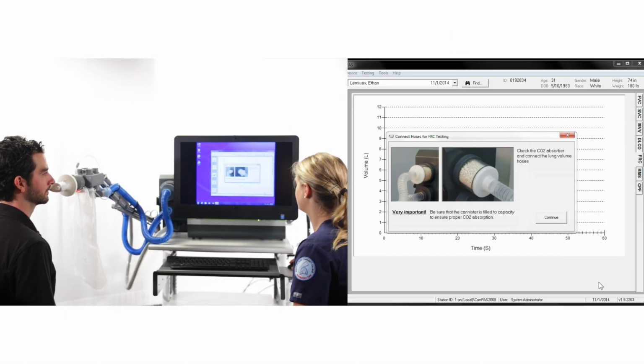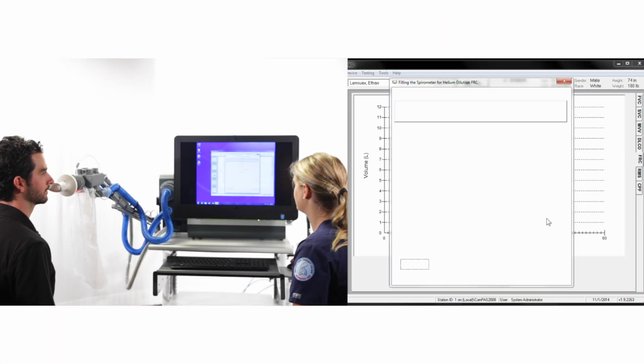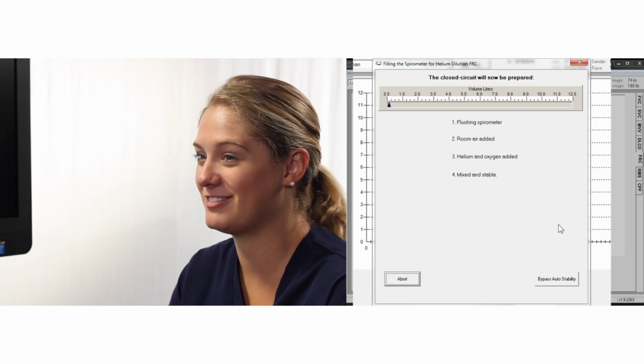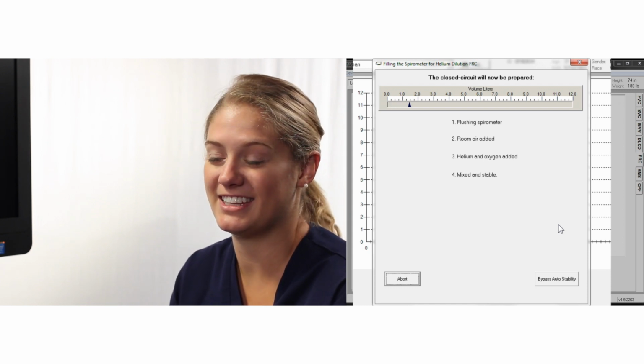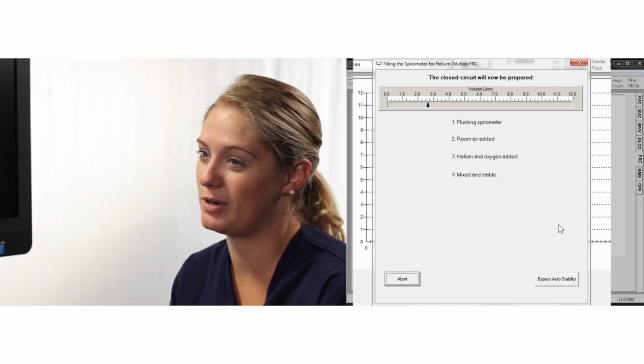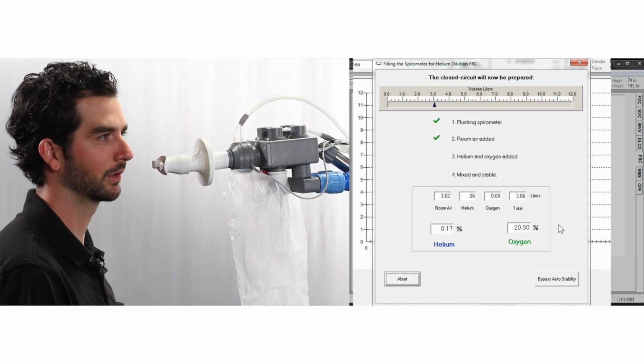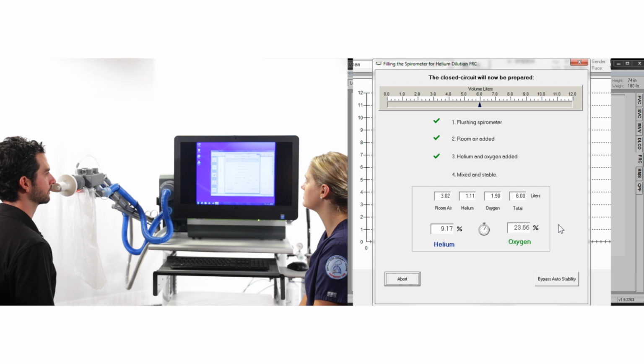If it has turned pink, it will be necessary to change the chemical. Before a helium dilution test can be run, the system will automatically prepare the closed circuit. A pop-up window shows the status of the automatic flushing and filling routine on the SpiroAir. Having flushed the spirometer and filled to the midpoint with room air, helium, and oxygen, the software checks for any leaks and waits for a stable starting helium value.